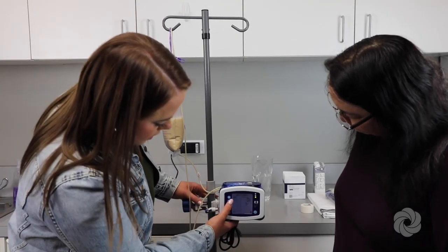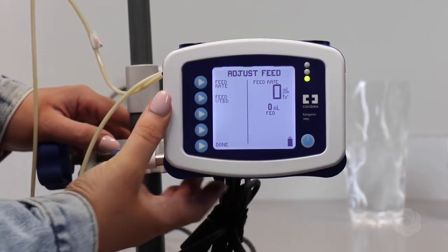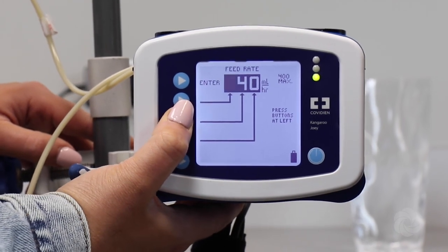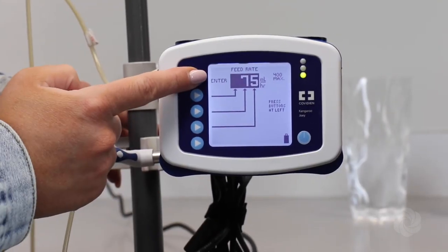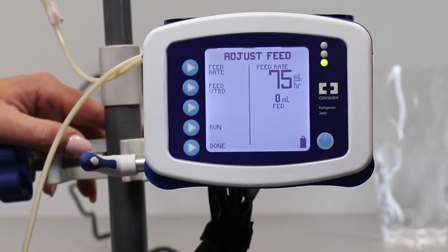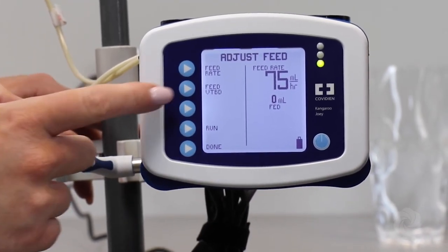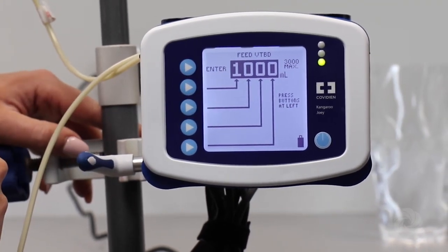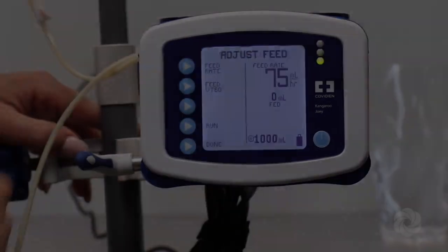Select adjust feed, then feed rate, and use the buttons on the left to program the infusion rate per the tube feeding order. Select enter when the rate is set. Select feed VTBD (volume to be delivered) and use the buttons on the left to program the ordered volume. Select enter when the volume is set.